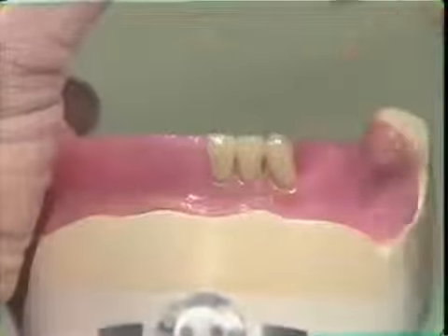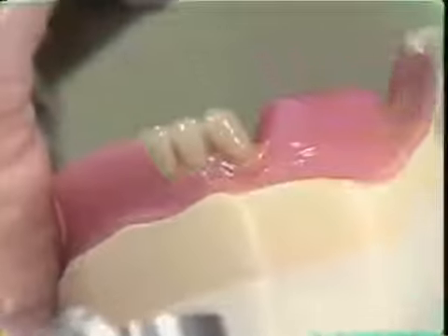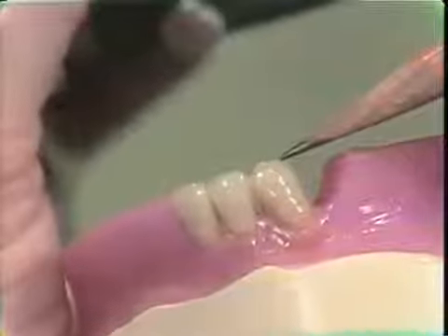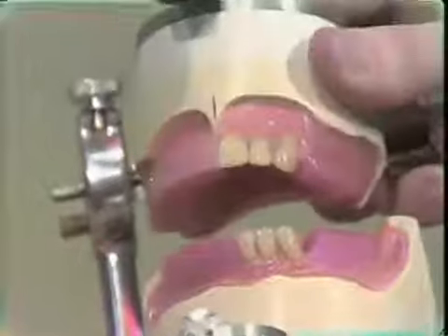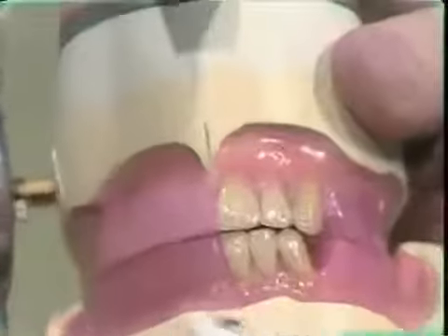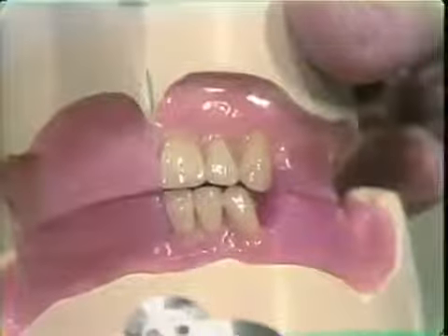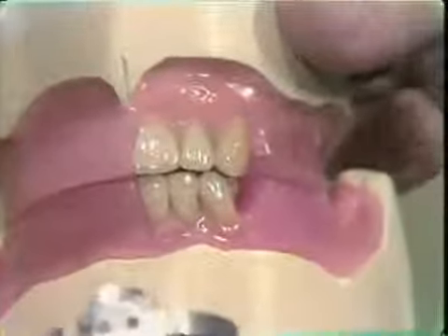The mandibular cuspid is set with the cusp tip slightly higher than the lateral and central incisor, with the neck prominent and tipped slightly to the distal. The horizontal and vertical overlap is maintained. The maxillary lateral incisor was placed 1 millimeter above the occlusal bite rim. Thus, the vertical overlap in the central incisor area is 0.